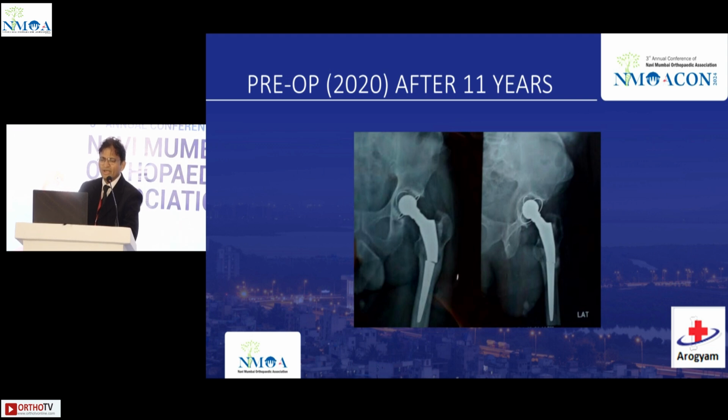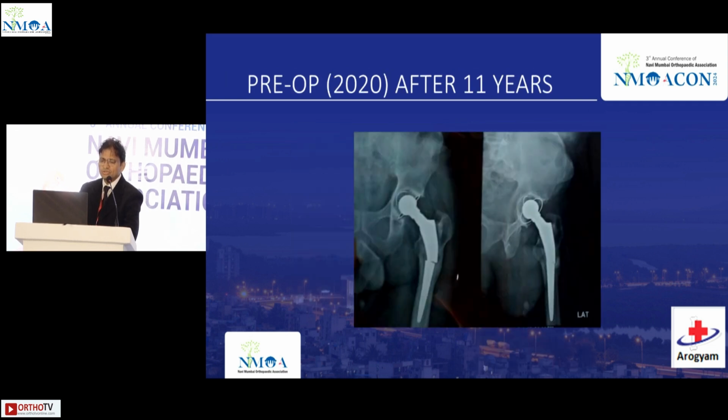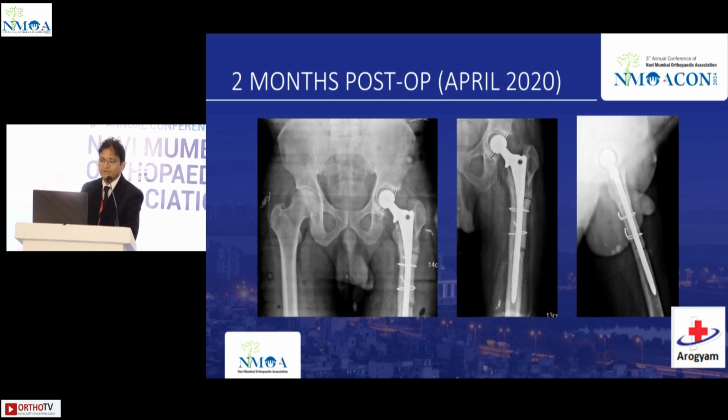So we had an option that we could have gone ahead and done an ETO. So we tried to do a window osteotomy. In this we removed the proximal part of the stem. We didn't touch the acetabulum, and after doing the osteotomy we removed all of the cement and the broken stem, and we fixed the window back in its anatomical position and encircled it.